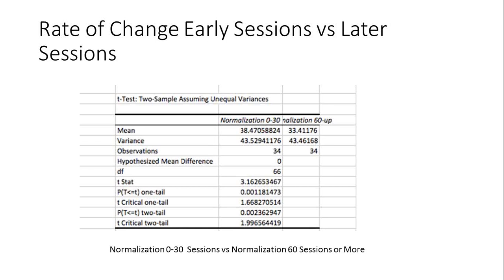So it is faster. Neurofeedback is faster. The normalization is faster. It's not statistically significant, but you will notice it, and everybody mentions it, that if you have a person with a lot of metabolic problems, they report their changes at a much slower rate, and the changes are diminished compared to people with lower metabolic scores. So again, we need to be careful about just looking at things purely statistically, and to look at things analytically and in terms of clinical application.